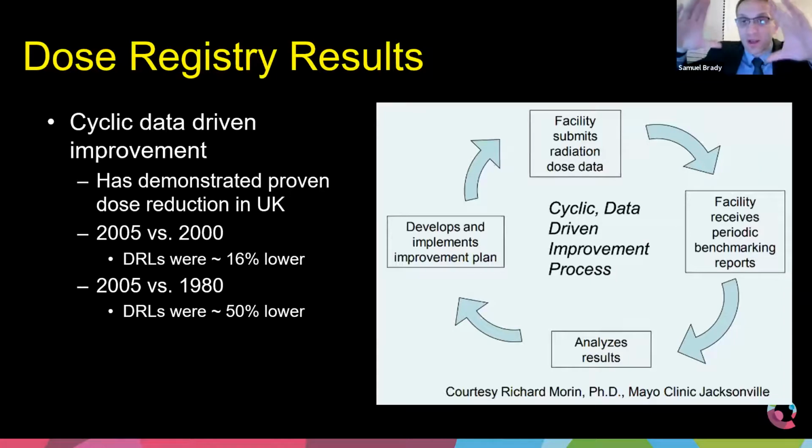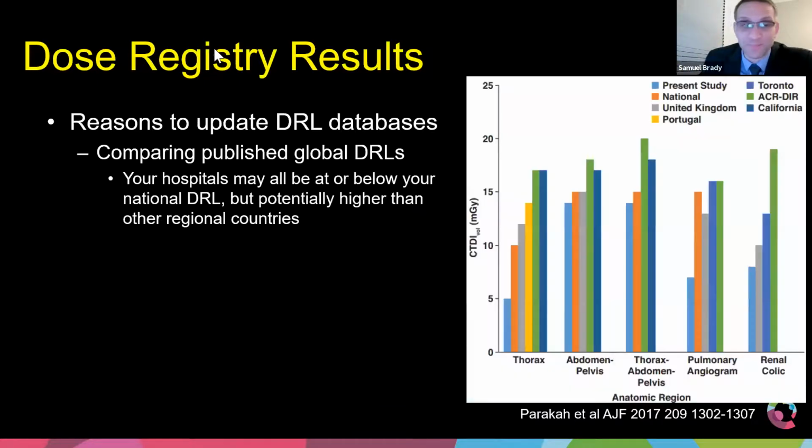Because as everyone improves, your 75th percentile is obviously going to lower. And as long as you're also looking at the image quality, that gives you the opportunity to improve the amount of radiation you use medically for your population. And how we refer to the idea that where your background radiation is so low compared to the amount of medical imaging radiation that you potentially use in Thailand, as time goes on and that medical radiation comes down, that's a win-win for you in Thailand.